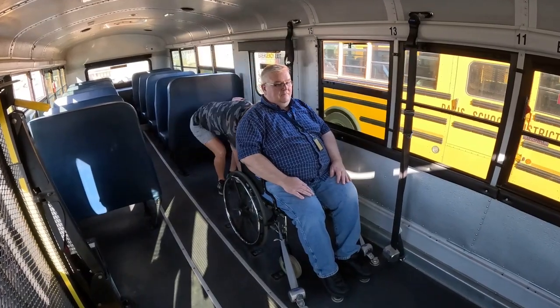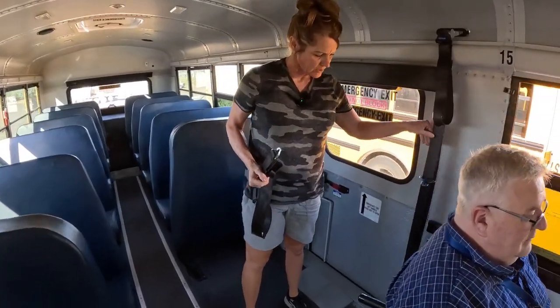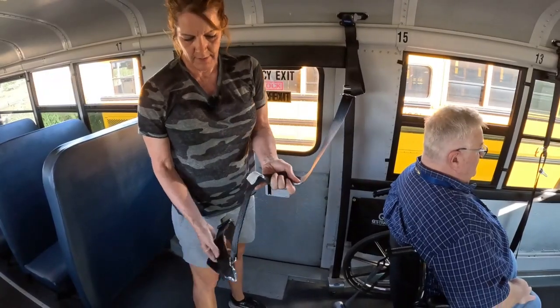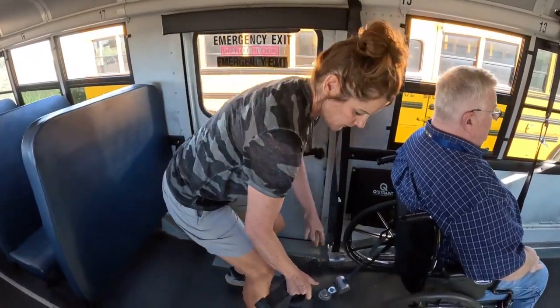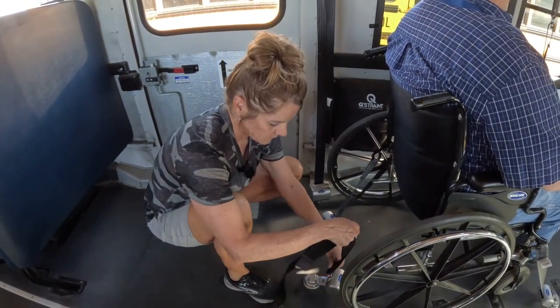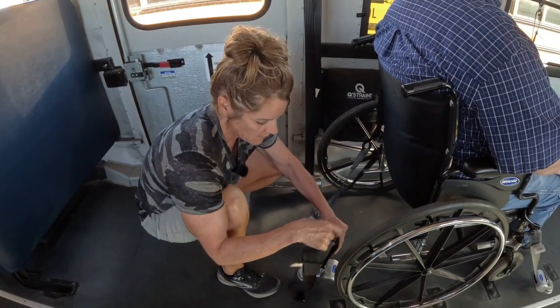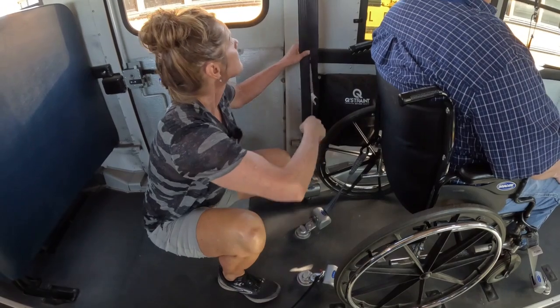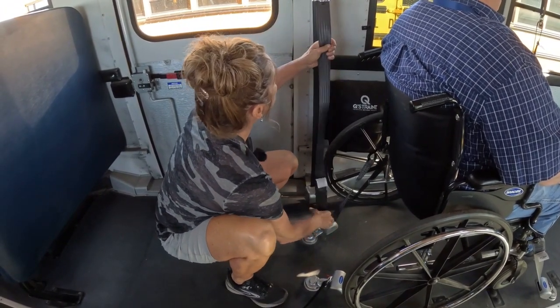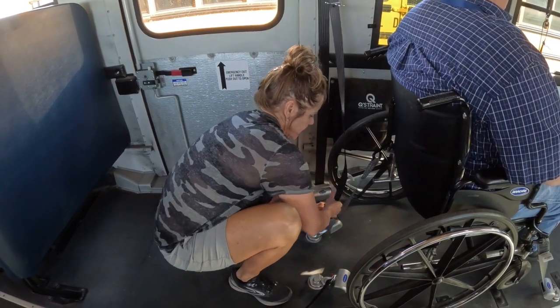Then you have your lap belt, and your shoulder strap. And they both have this little hook on them. So your lap will go over here. It's flat on this side, and that's what goes on the knob like that. So it's flush. Just pull it up and lock it. Same thing over here. Make sure it's flush. Try to make sure it's not too twisted. Lock it.